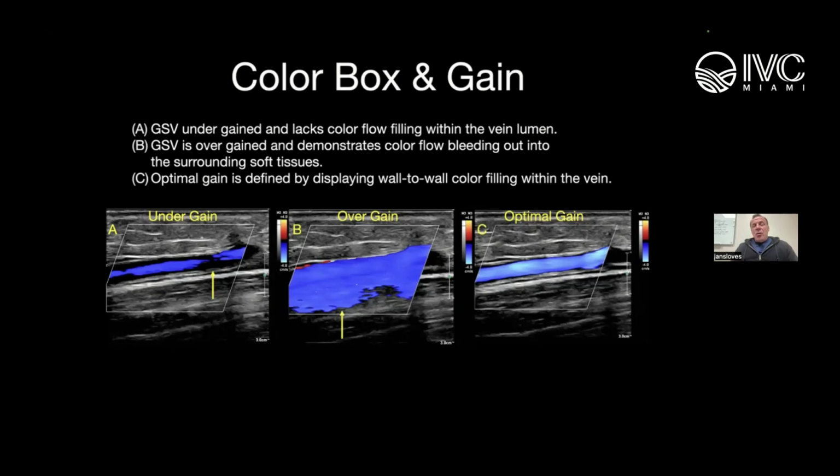Again, no matter what you're doing in ultrasound from the head to the toe, you never want what I refer to as messy or sloppy Doppler, right? When that color bleeds into the tissue like this, you run the risk of covering up anatomy and disease, and you don't want that. You want to be able to make sure that you're very in tune with your controls as it relates to your color scale and your color gain.